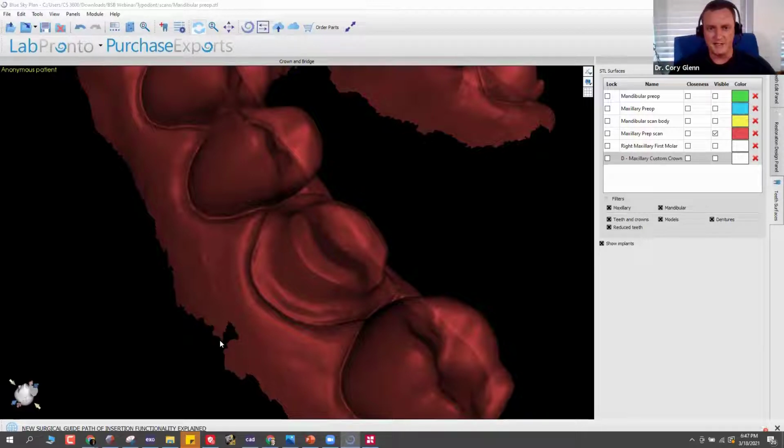Do you buy a selection of shades and can color be modified by staining? You can definitely stain it. And they do have 5 or 6 shades of this. Posterior crowns, I'd probably be the guy that had A2 for everyone, but yeah, there are multiple shades. And again, they're big upfront expenses, but you don't have to buy a liter. You can buy a half a liter, and you also get a lot of crowns out of that resin. So that's not as painful. Are those all answered now, Michael, or was there more?